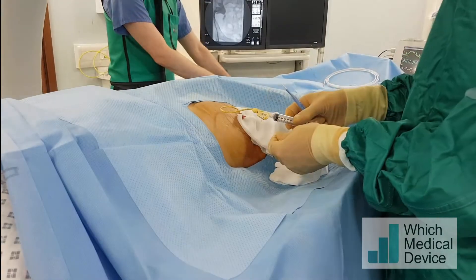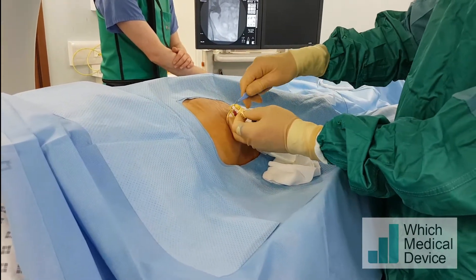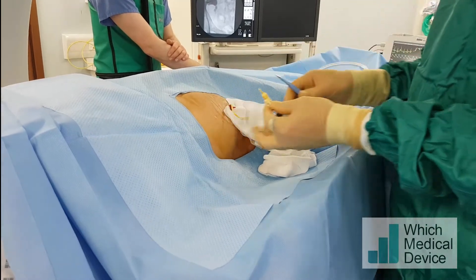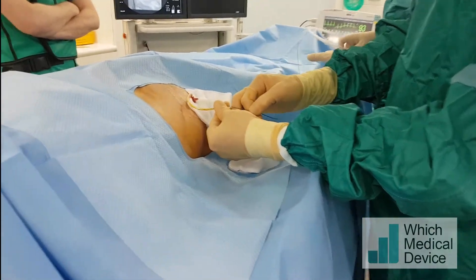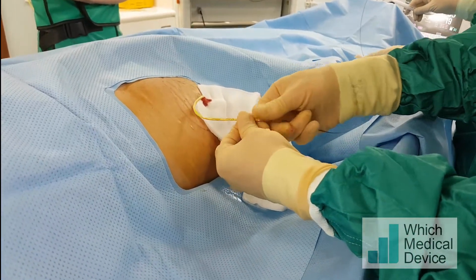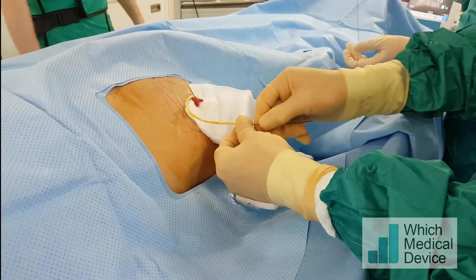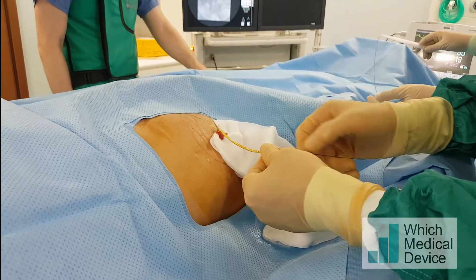This Cook locking pigtail catheter — it's best to release the locking mechanism just by cutting the catheter. I'm going to cut it there and that will release the thread, and now I can advance a guide wire through into the collecting system. This is just a soft tip Benson guide wire; we're going to push it right into the collecting system and then exchange for a catheter.